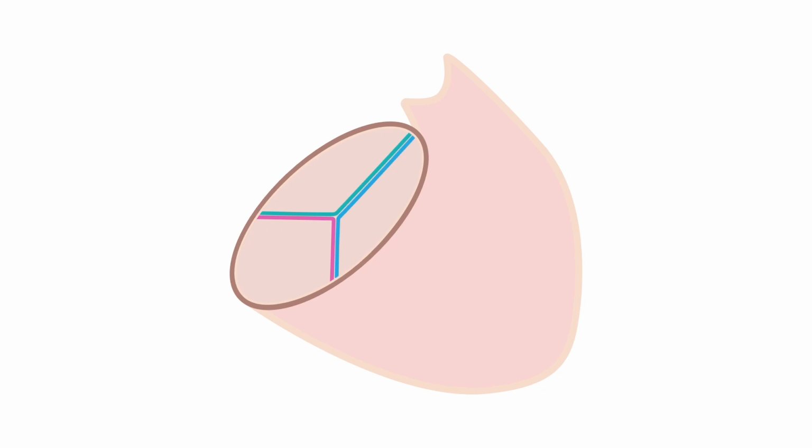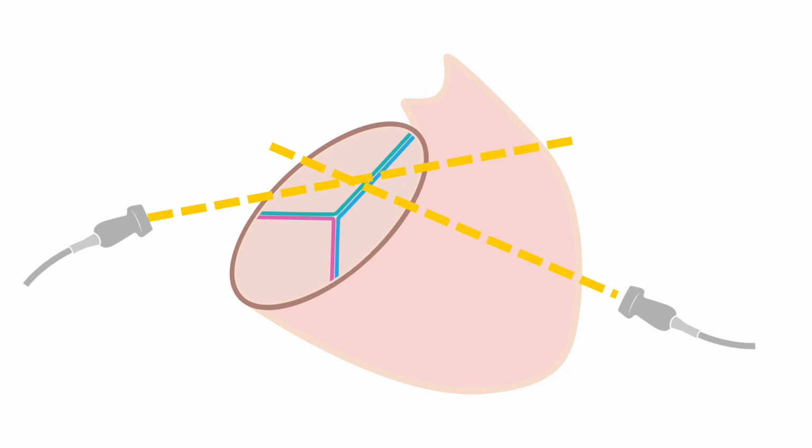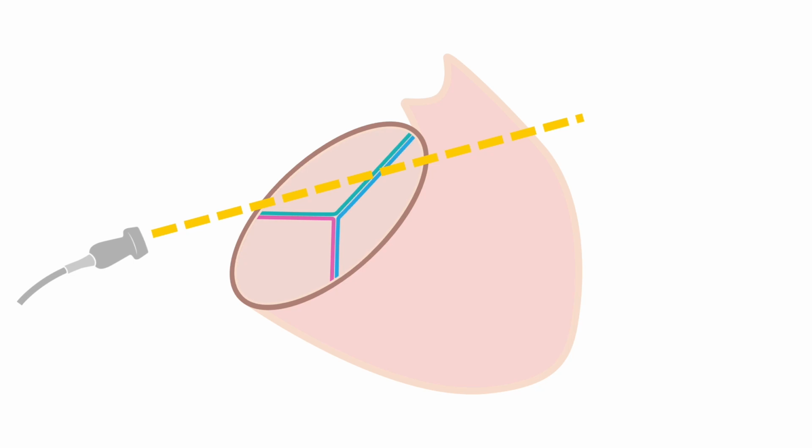To understand this, let's look at the tricuspid valve in perspective and try using different probe positions within our range of motion to demonstrate this limitation. Let's try this probe position to start. No luck. In this view, the 2-dimensional image will only show a portion of the anterior and septal leaflets.